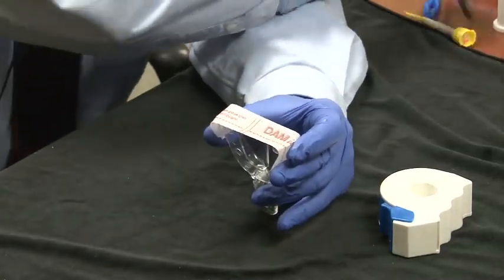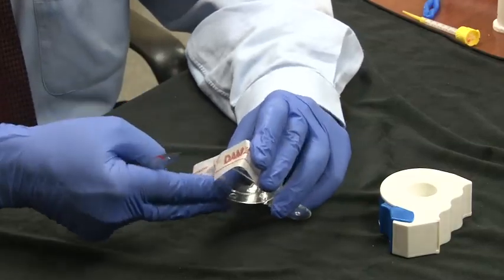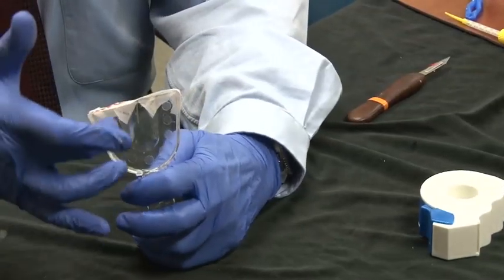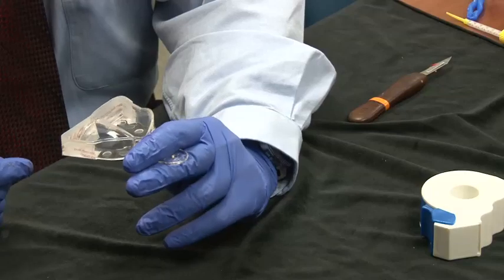Again, just like before, take your knife, notch it, and then just fold it up and around. So now, again, you have your nice distal walls to capture this so the patient doesn't gag so much. It doesn't flow back so much.